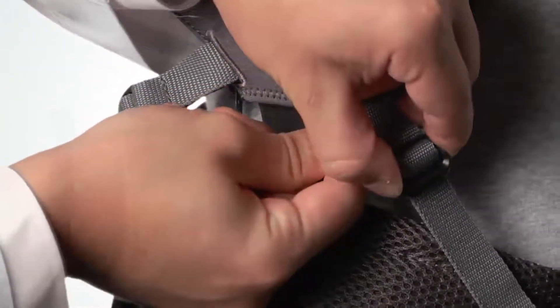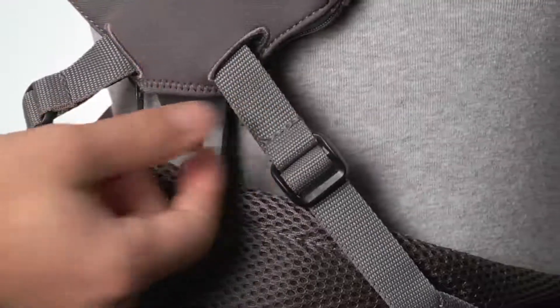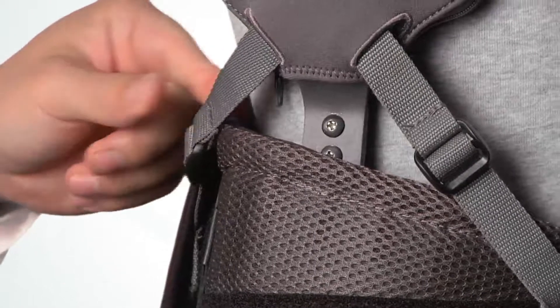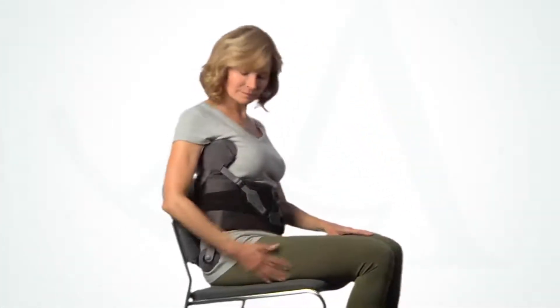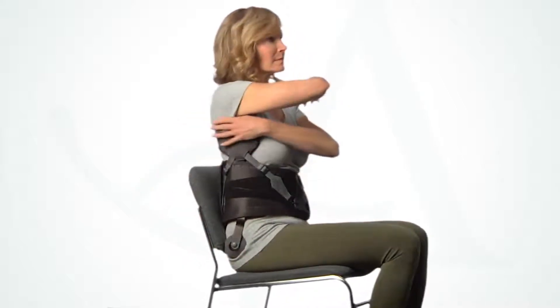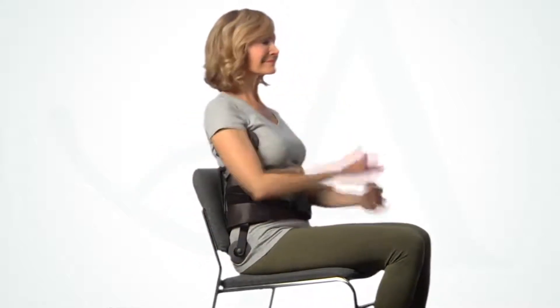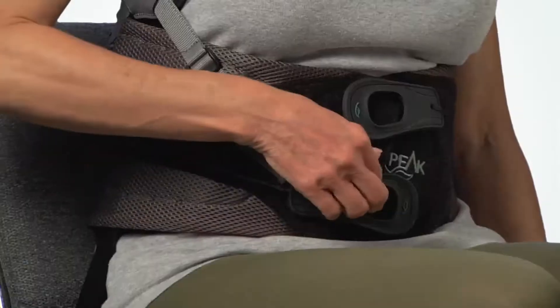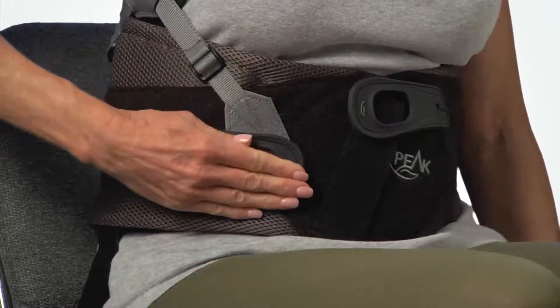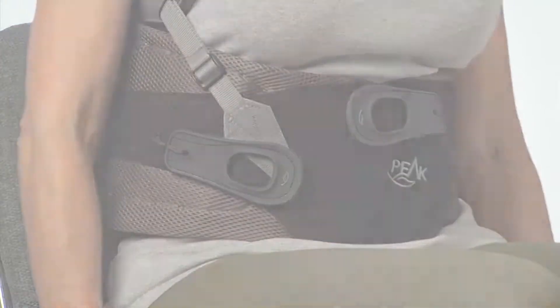Remove any slack by tightening the anterior and posterior tension straps. If additional force applied by the thoracic pad is required, either tighten the tension straps further or bend the thoracic strut. The final step is to confirm that the brace is comfortable while seated — check that the trochanter pad is not too low and that the thoracic pad is not uncomfortably high. To maintain effective, comfortable support while seated, it can be helpful to slightly loosen the upper portion of the brace by adjusting the right pull tab.